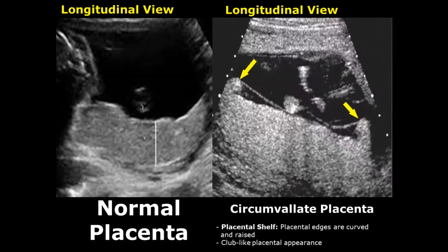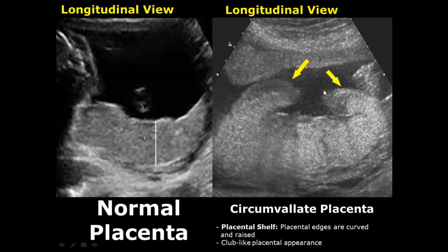A circumvallate placenta will have raised, rolled edges; this raised rolled edge is known as a placental shelf, giving it a club-like appearance. Normally the amniochorionic membranes attach to the edge of the placenta, but in this situation they attach on the interior surface of the placenta. Here is another case of circumvallate placenta where we can see the raised and curved edges.